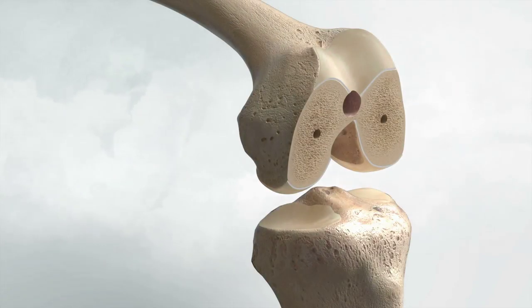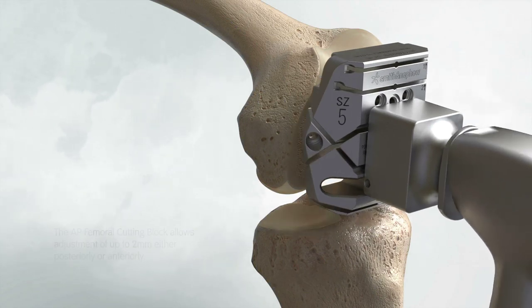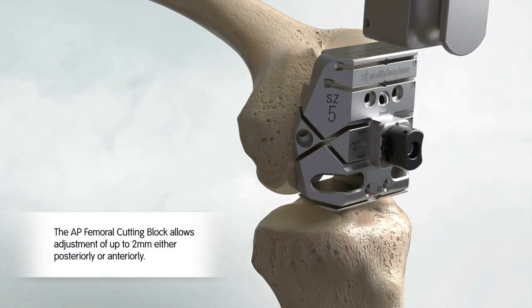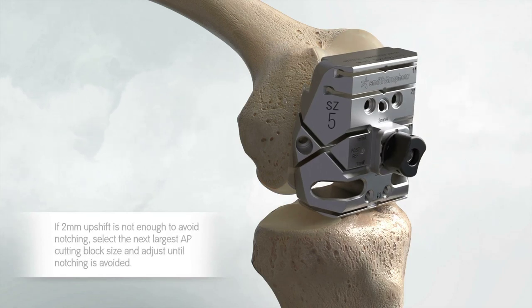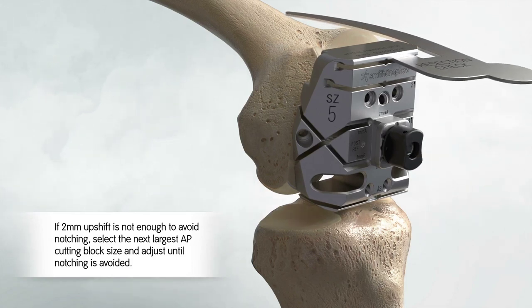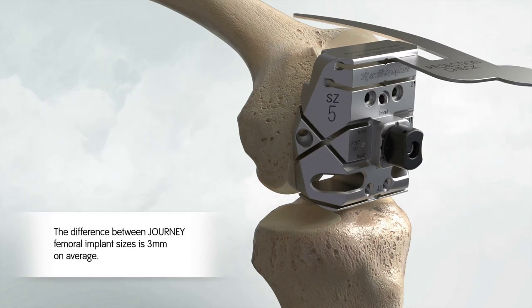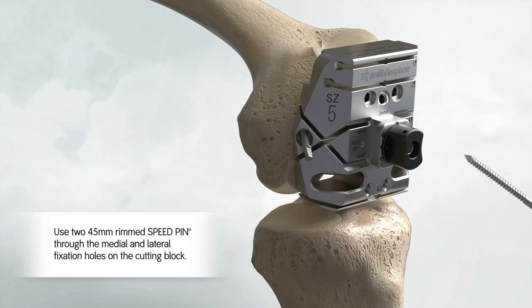Position the spikes on the DCF AP femoral block into the pre-drilled holes. Use the mallet to impact the AP block assembly until the block is flush with the resected distal femur. Remove the AP block impactor. Note that the posterior resection will match the implant thickness when the highlighted indicator in the AP block knob is aligned with post-ref. Use the Angel Wing to check the location of the anterior cutting slot. Make any necessary anterior-posterior adjustments to avoid overstuffing the patellofemoral joint, overstuffing the flexion space, or femoral notching.